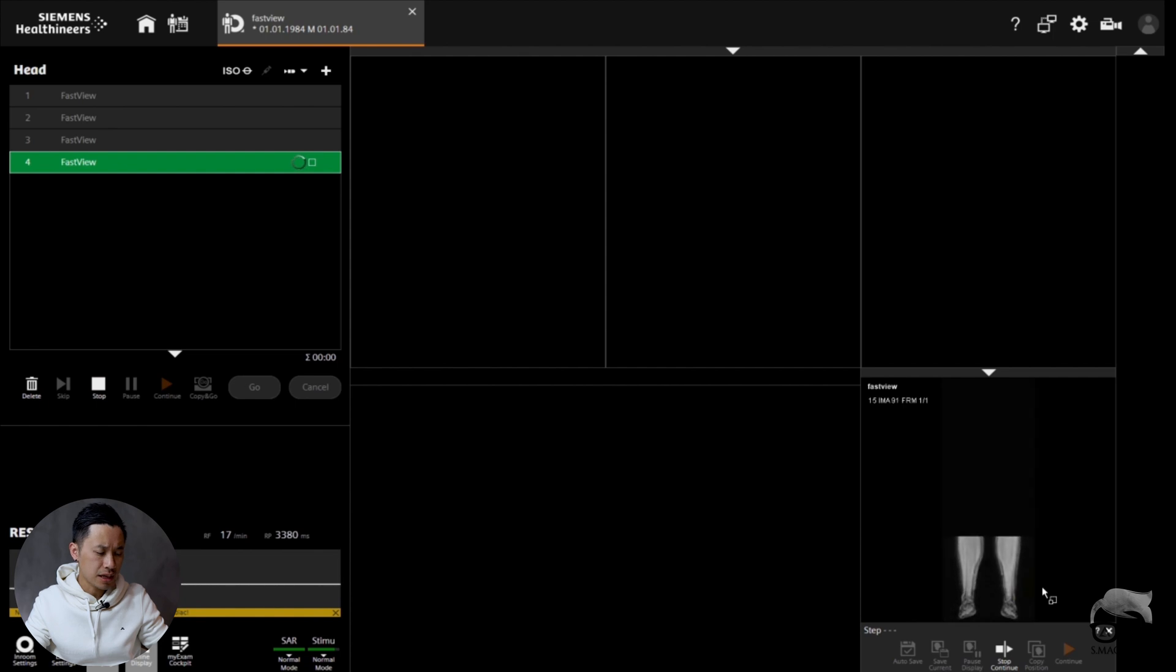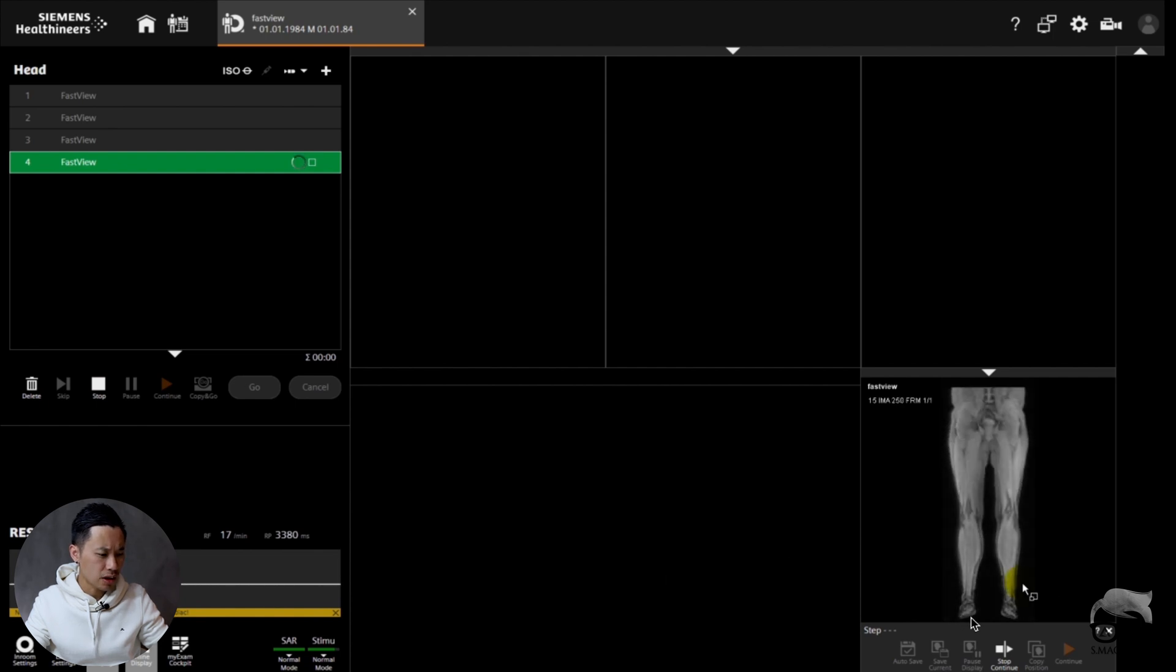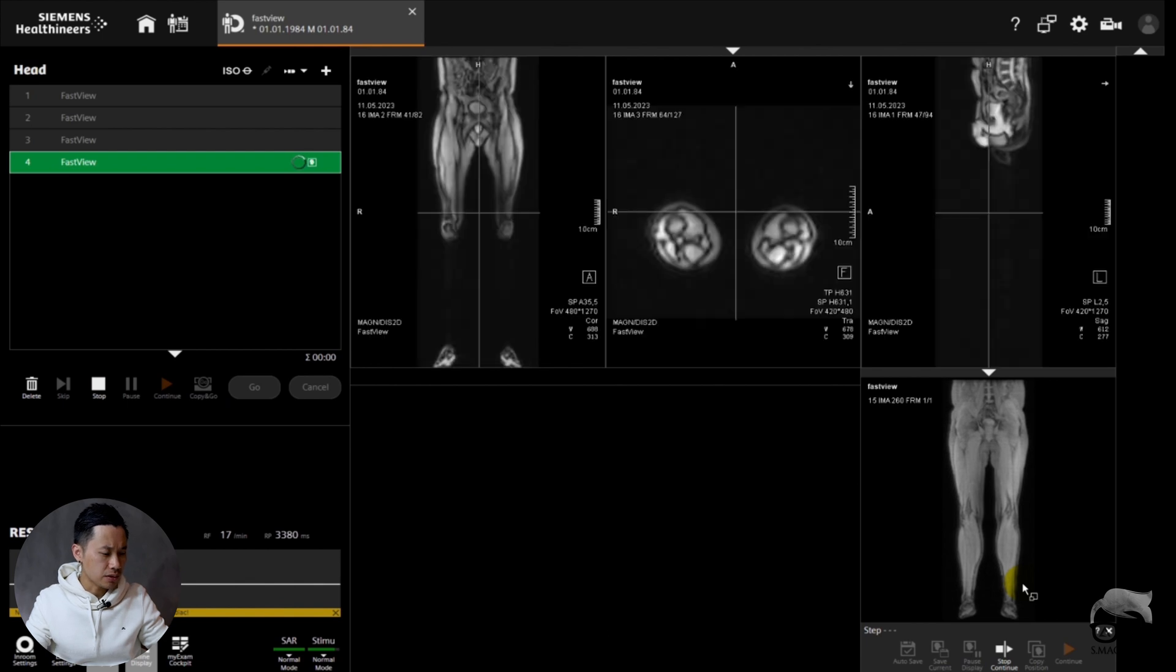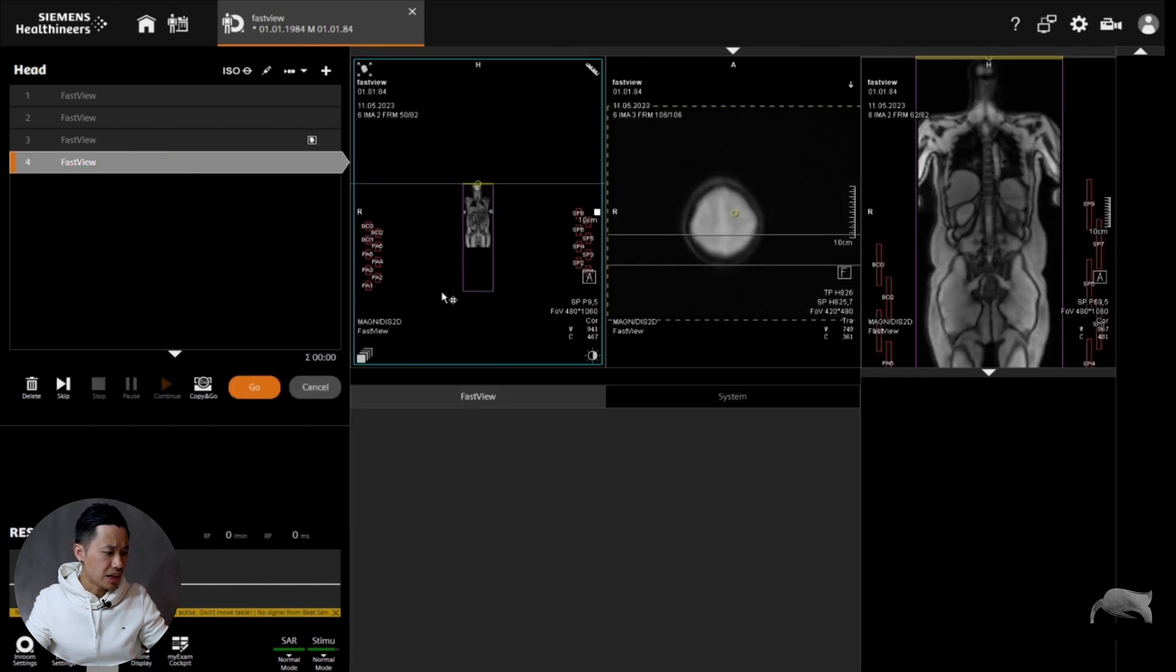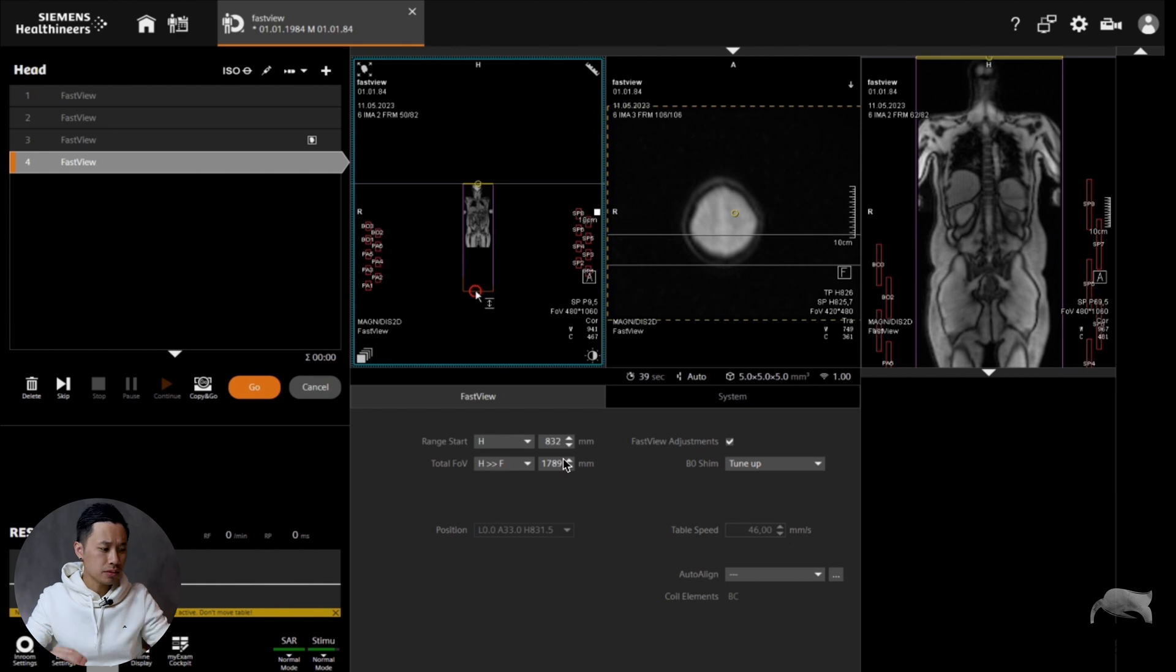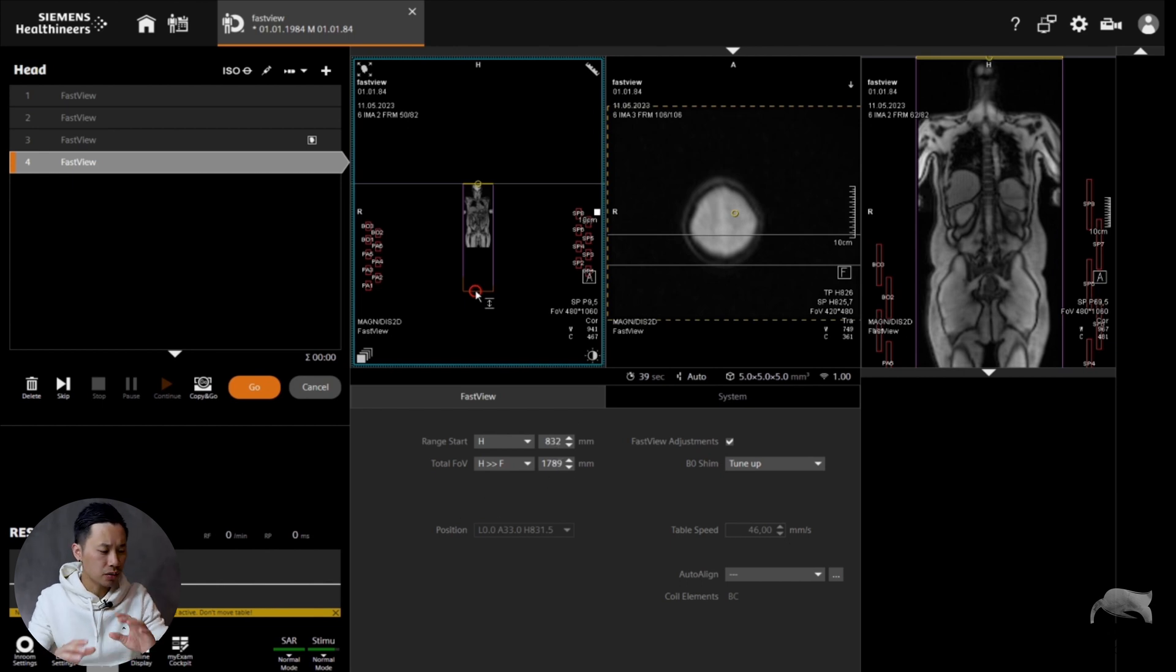Seems to be working! So my ISO center is down here like I showed, and it's working as well. Whenever building a protocol, I would definitely use zero right here because I want it to start spot-on whenever I'm using my ISO center at zero.